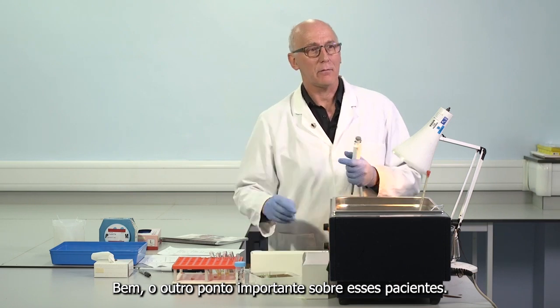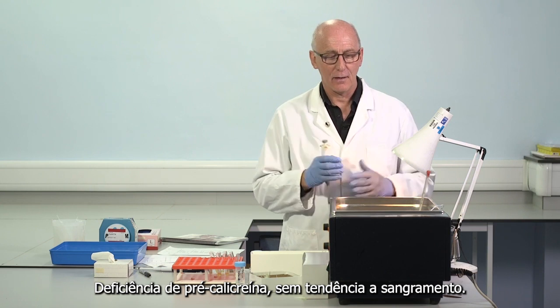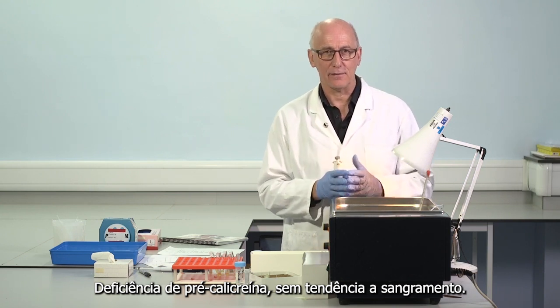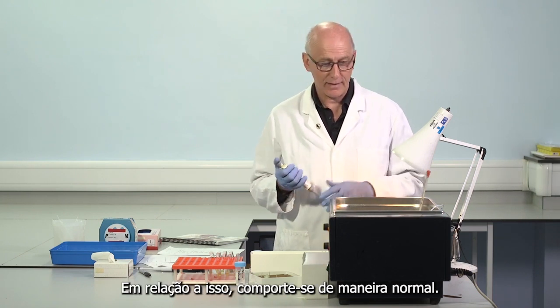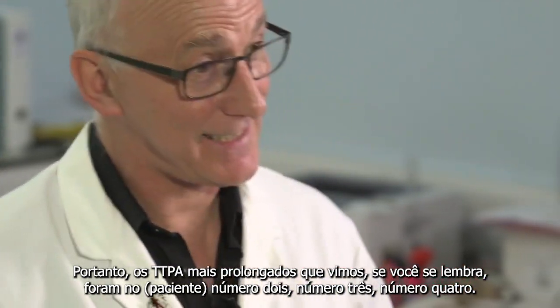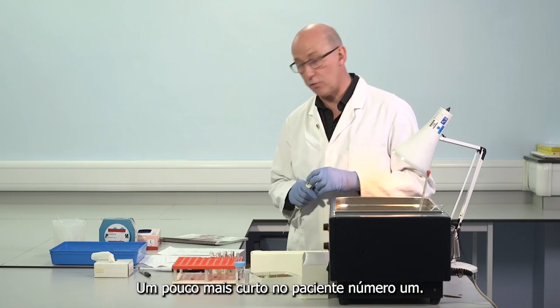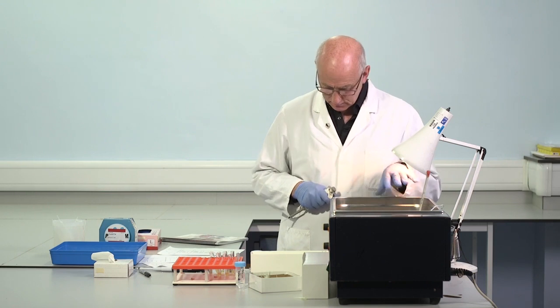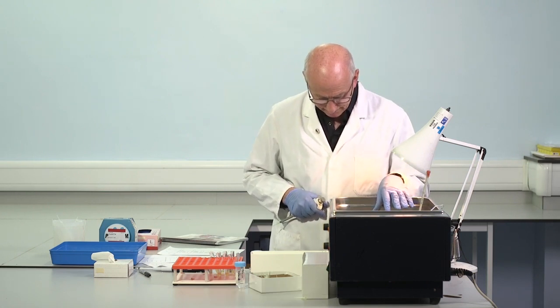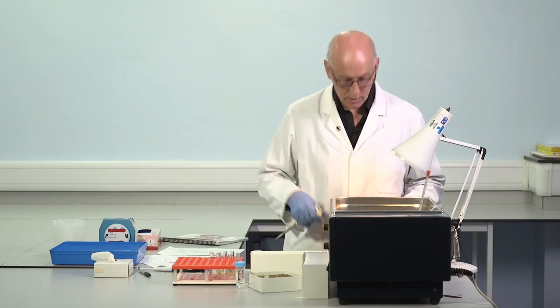Well, the other important point about such patients, pre-kallikrein deficiency, no bleeding tendency. Absolutely no bleeding whatsoever in relation to that. They behave in a normal way. So the most prolonged APTTs we saw, if you remember, were in number 2, number 3, number 4, a little bit shorter in patient number 1. Control is incubating and we're up to 3 minutes.